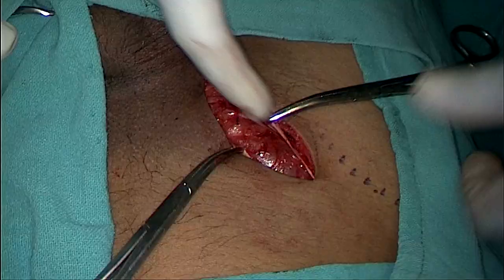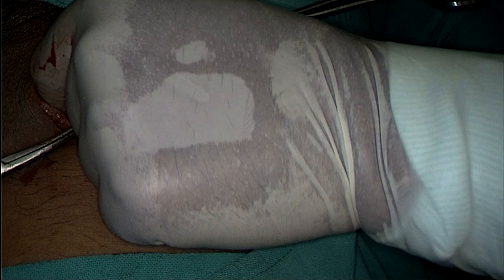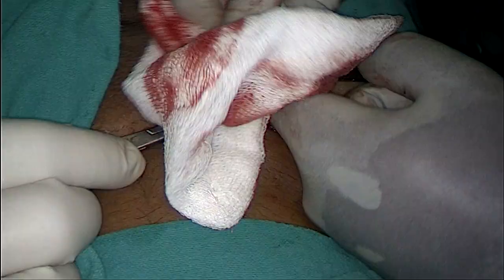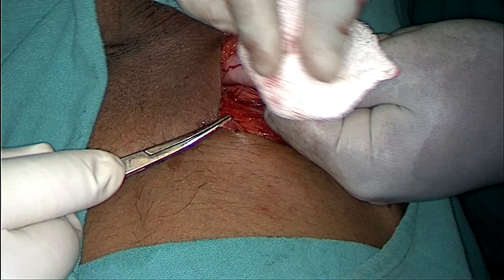For dissection you can use your finger; sometimes a gauze piece can do the job. As you can see, I'm using my left index finger and thumb to hold the cord with the sac and try to deliver it outside so that we can start separating the cord from the sac. As you can see, the cord with the sac is now delivered.